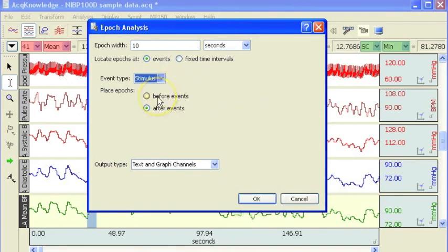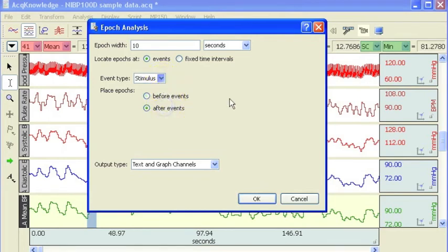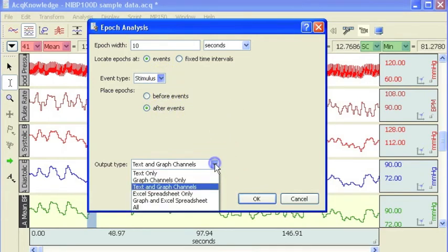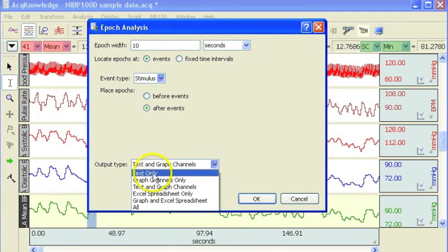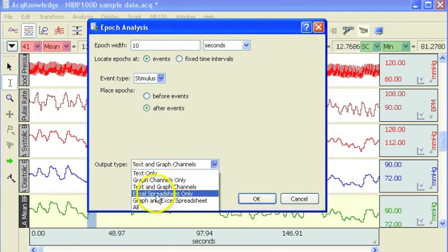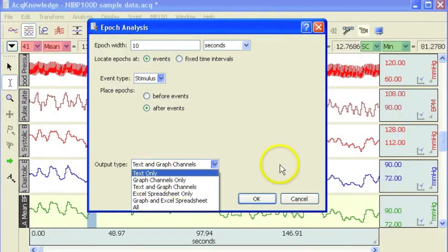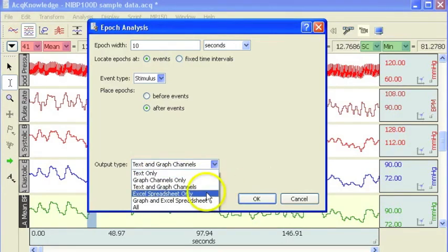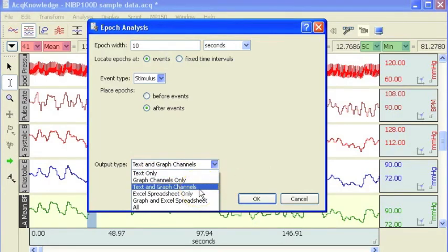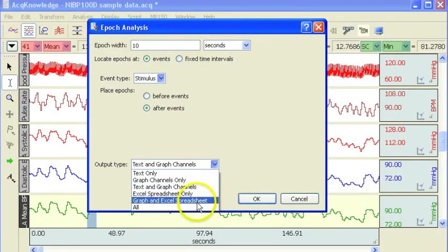Then we can say we want to take our measurement before the event mark or after the event mark, and then select whether we want to paste into the journal or a spreadsheet, or whether we want to graph the measurements as new channels, or whether we want to do both. Journal and graph, or graph and Excel.